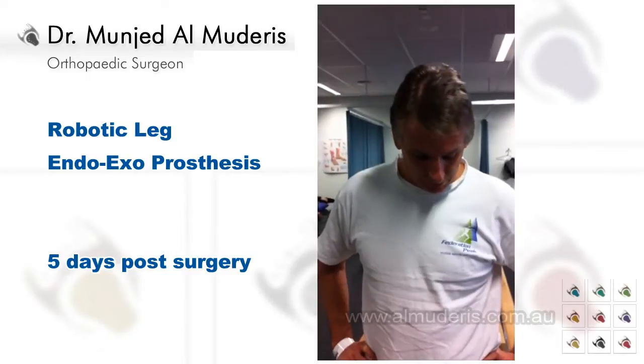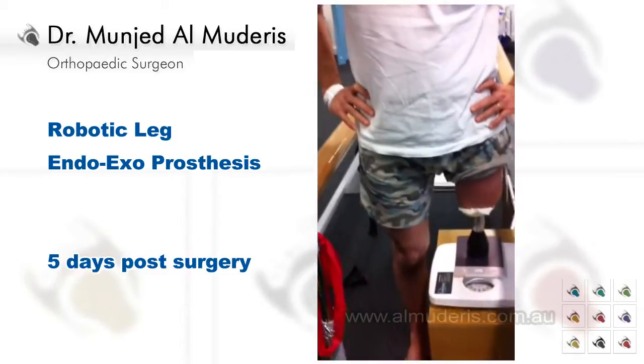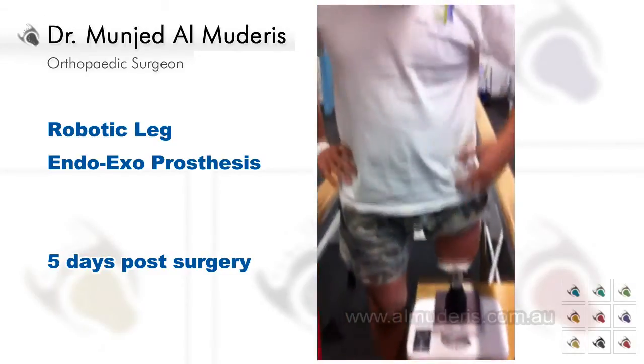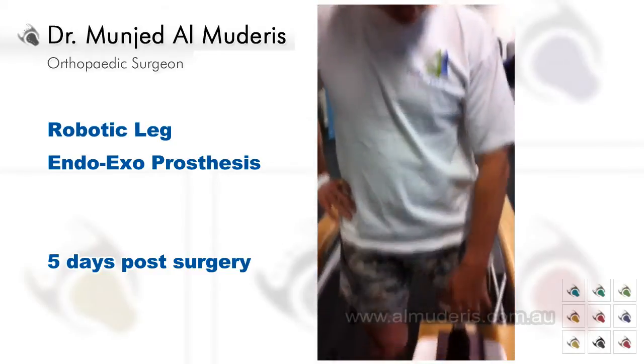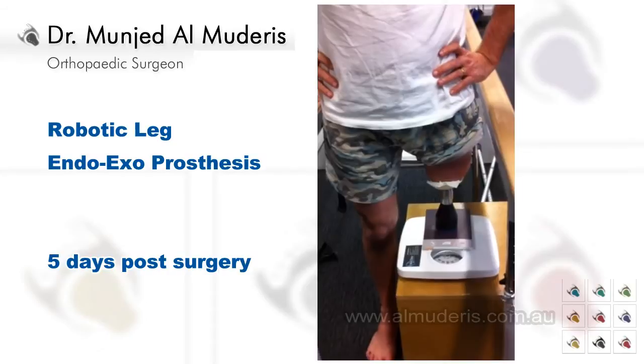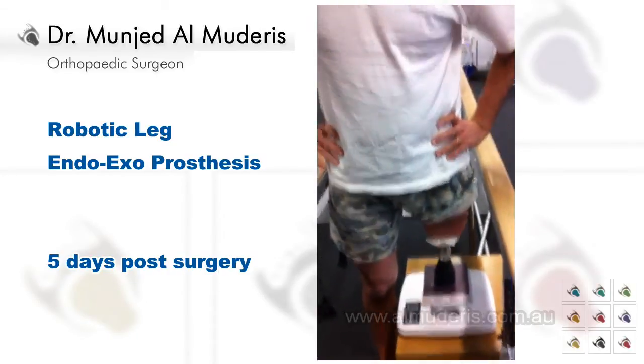Do you have any pain? No, it's been really good. No bone pain, just a bit of wound pain, I think. Nothing at this end — it's all just around the side. Any discharge? No, discharge has been really good.